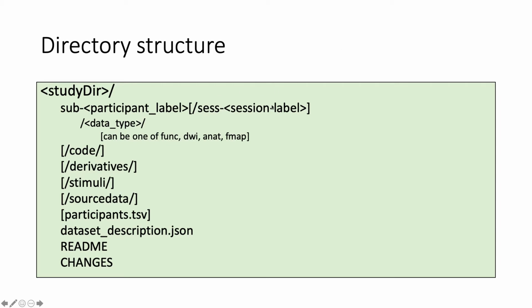We also have the option of including a session label. So what that means is if you scan someone multiple times over the course of the experiment, you can actually label this as session 1, session 2, and so on to keep those separate.